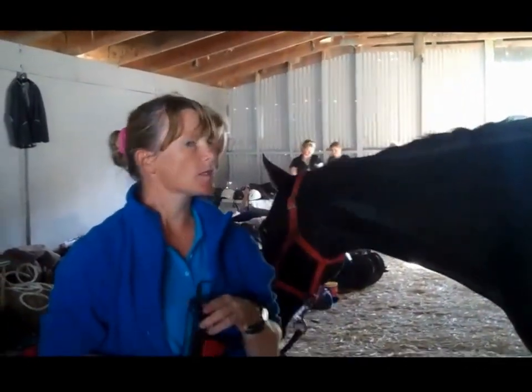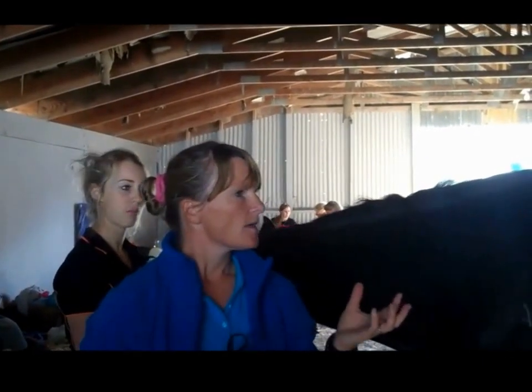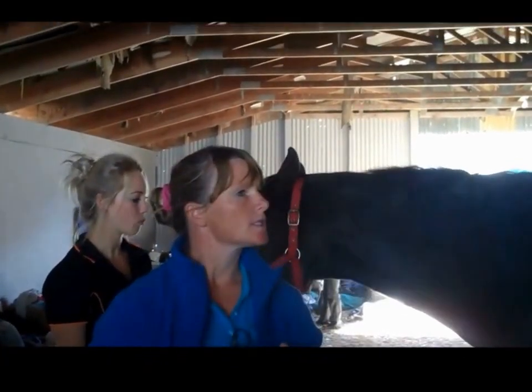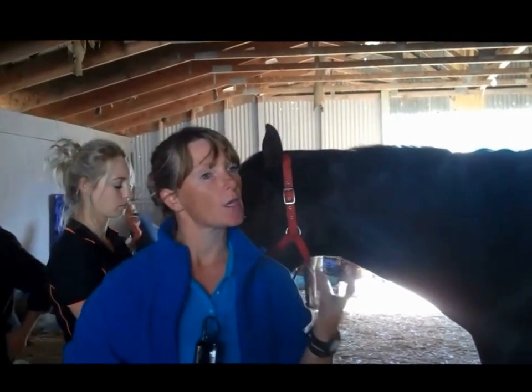I've been treating horses for about 13 years, and there was always a time when the horse goes to the vet and there's nothing wrong. From a therapist's point of view I can't always feel everything. So with the camera it allows me to look at the horse and see stuff that you can't actually feel.